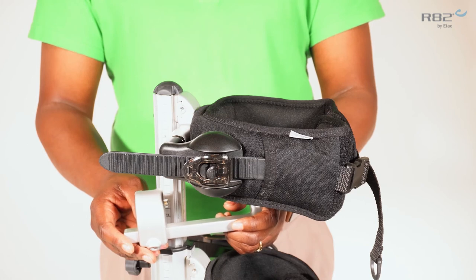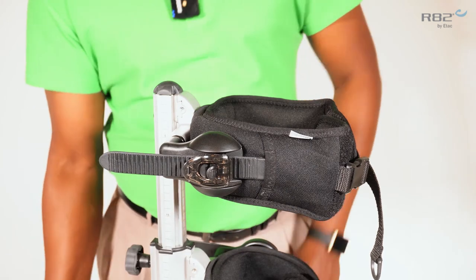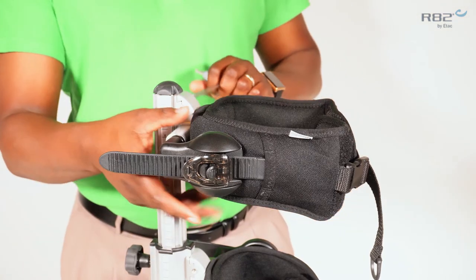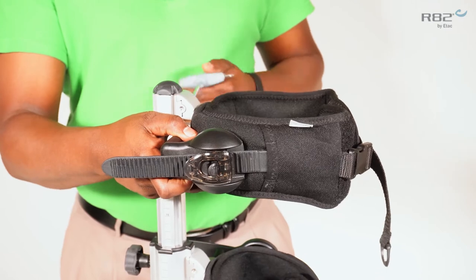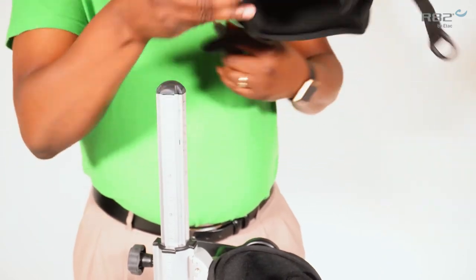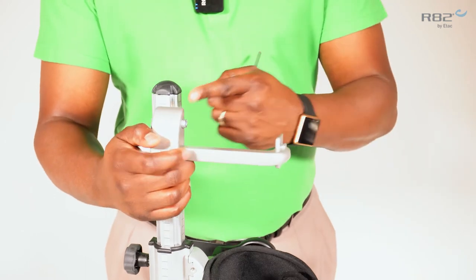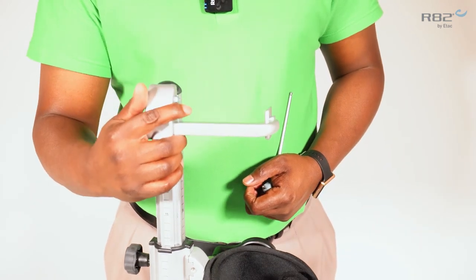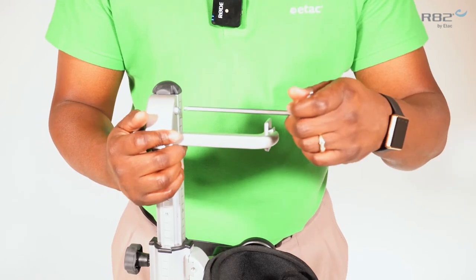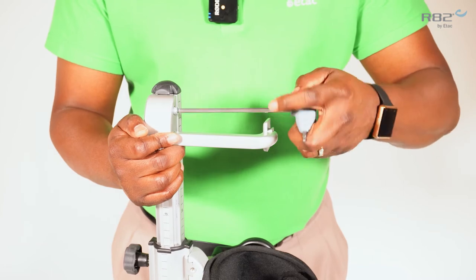The displacement kit can be used on the pelvic or trunk support to obtain proper alignment. To use the displacement kit on the trunk support, you must first unmount the trunk support. The displacement kit has the same universal mounting bracket as the trunk support, and it will mount on the side track.